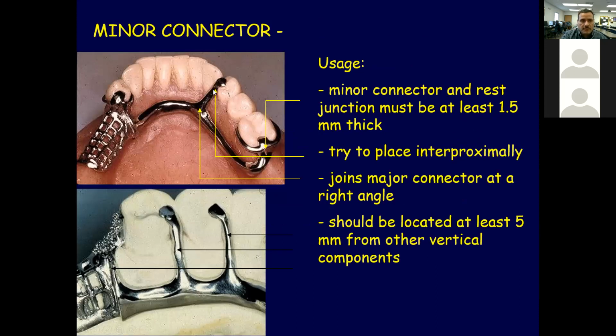So this is a minor connector. Let's connect the major connector here with the rest. This is a rest. This is another rest. This is another rest, and there's the clasp assembly. These are 3 rests. These are minor connectors, minor connector here, minor connector here.